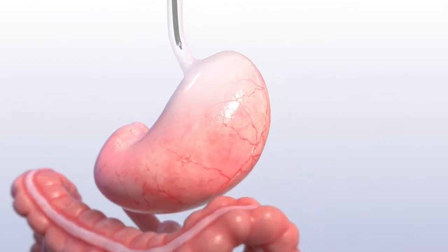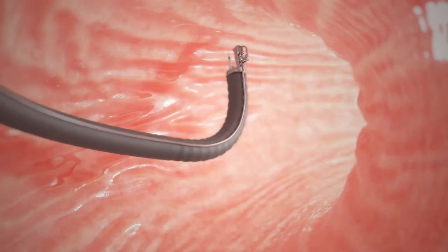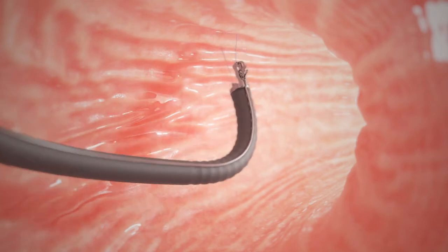A specially trained doctor passes the device and camera through your mouth and into your stomach. The doctor uses the suturing device along the large curve of your stomach to sew it into a smaller shape.